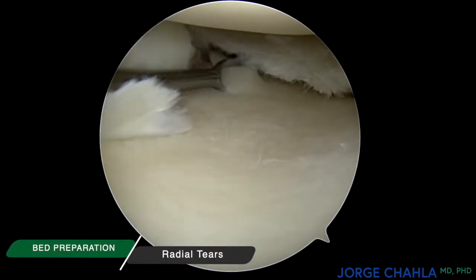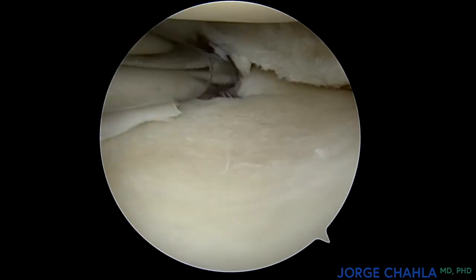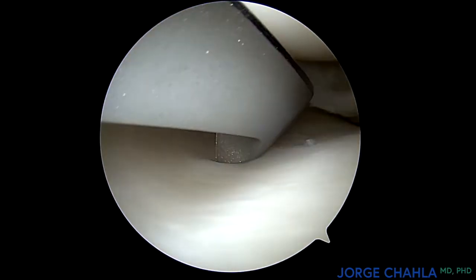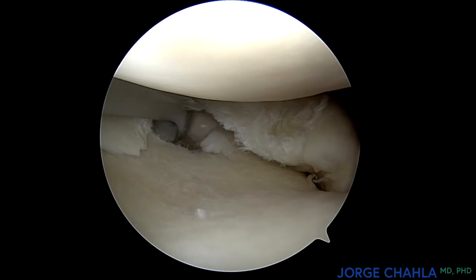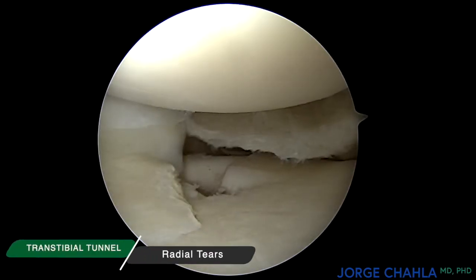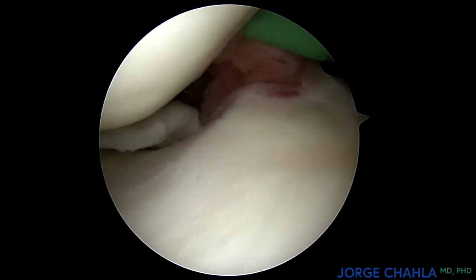A healing bony bed is then prepared with a ranged curette and shaver to assist with vascular healing of the lesion. An aiming device is used to create a transosseous tibial tunnel. This is drilled under direct visualization to confirm the tunnel entrance is at the prepared bony bed. A cannula is then inserted to assist with suture management.